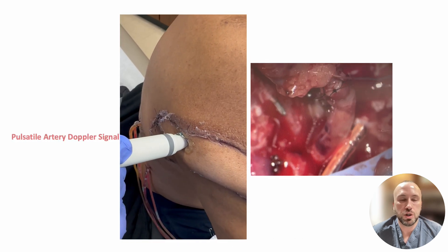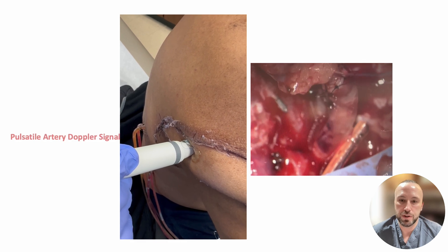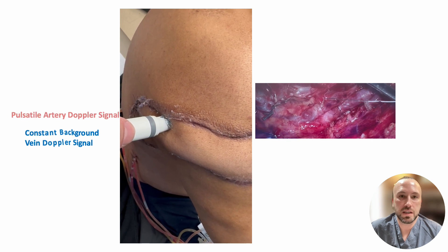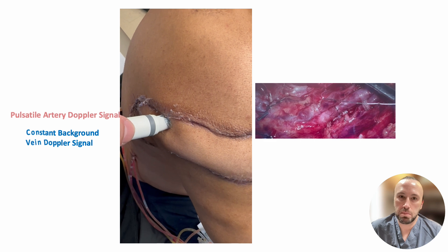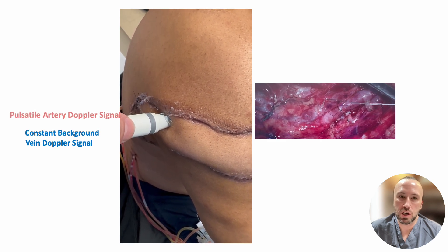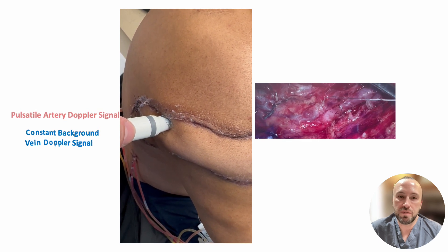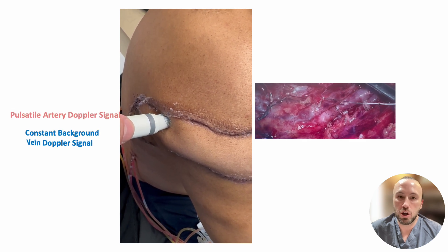In this video, you can hear the pulsatile sound of the flap perforator artery through the Doppler. You can hear the pulsatile sound of the artery, but if you listen in the background, between the pulsatile beats of the artery, you can also hear the constant sound of nearby vein blood flow. You may not always be able to hear the vein signal, but you should be able to hear the pulsatile artery signal.